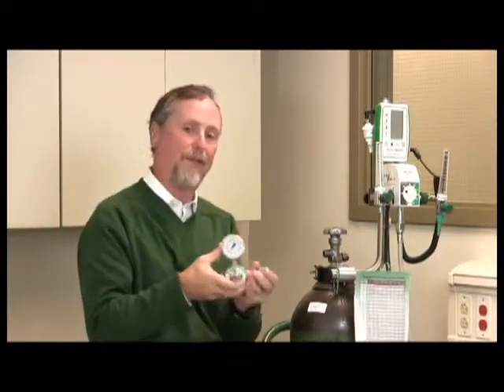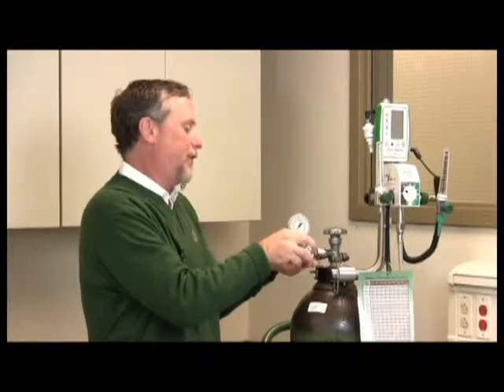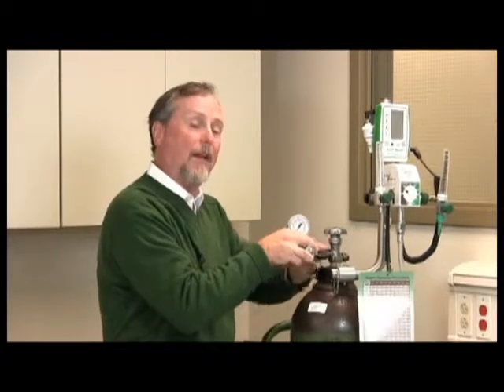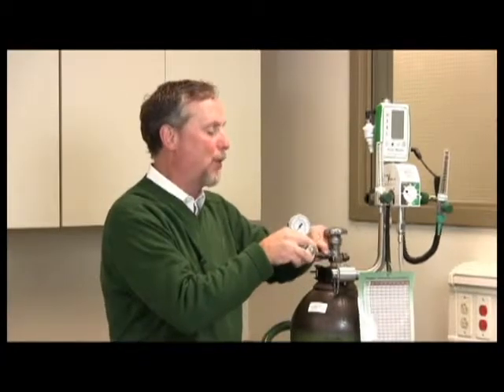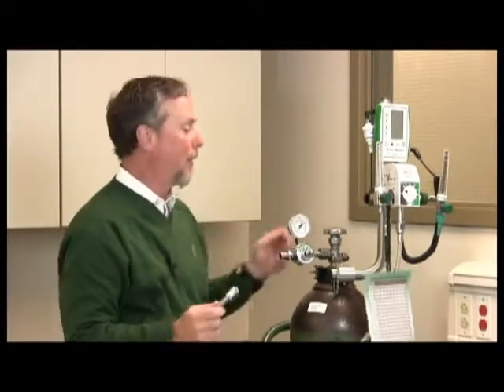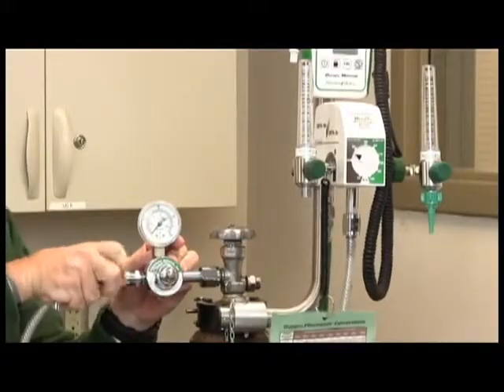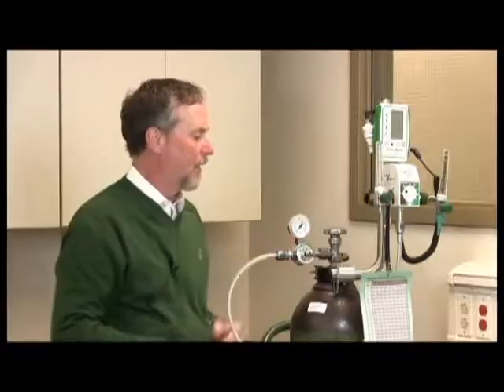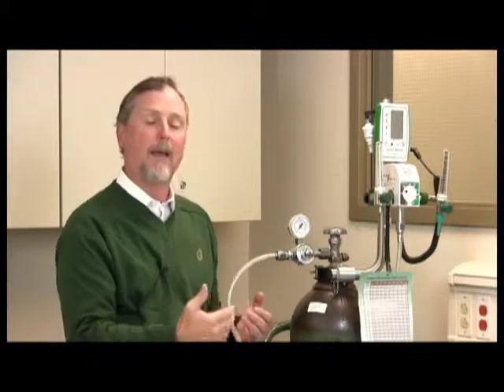This is our Heliox regulator, a 50 psi single stage regulator, CGA connection, DISS fitting. So the CGA connection goes on to the tank. And note that to use this blender, a 50 psi regulator has to be used all the time. First of all, this is DISS and this is CGA. They should not mix. But anytime you're using a cylinder with a blender, you have to use a regulator to reduce the pressure down to 50 psi. So this is our DISS connection onto here. So our Heliox blender, you can see, is installed with the regulator in place. From there, we can connect up to the wall, get the tank going, and start our therapy.